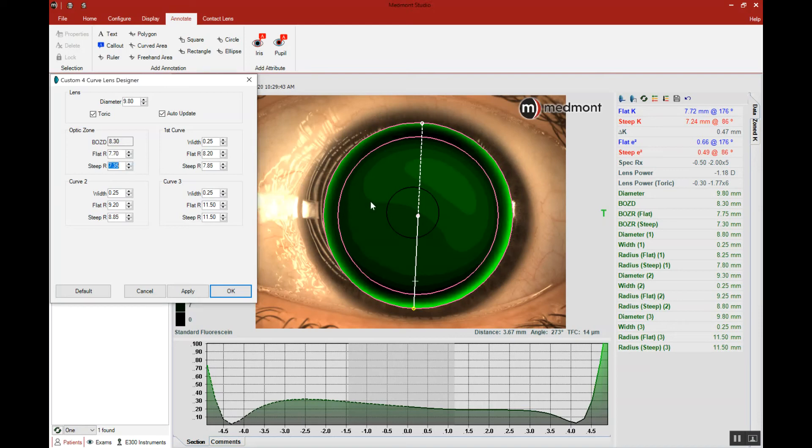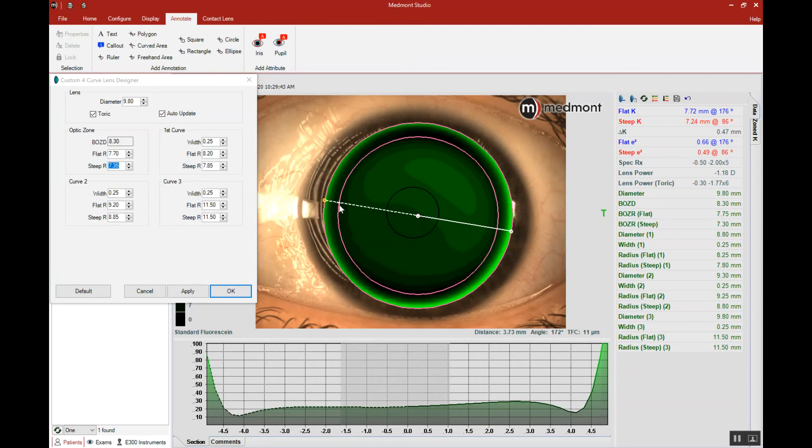So we're going to steepen the flat and flatten the steep meridian, and let's see if that change will give us the landing at three and nine o'clock and the channel across the vertical meridian.